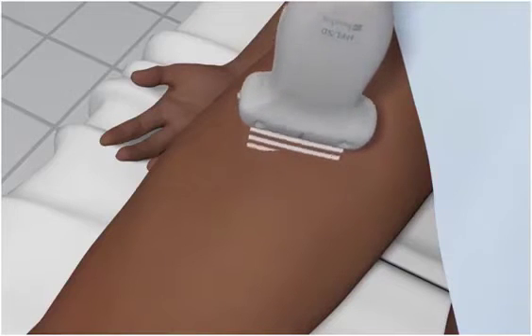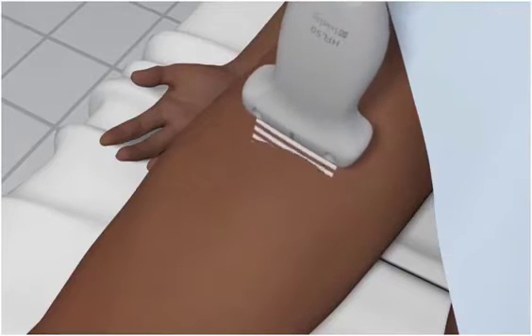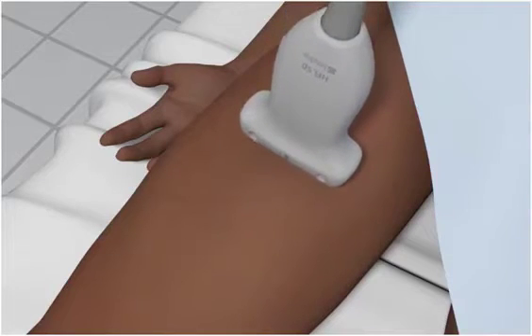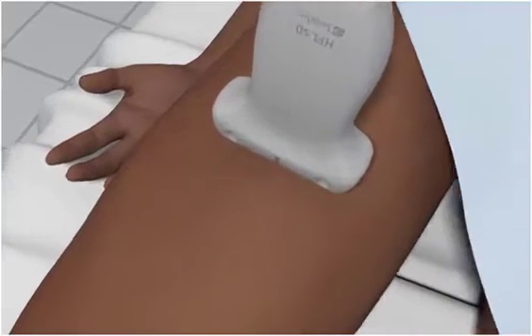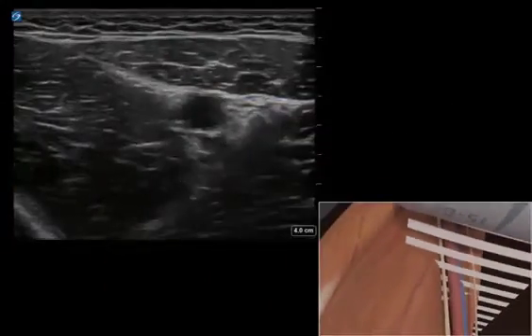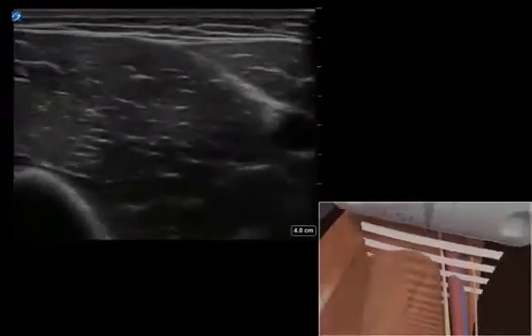The transducer is placed in the medial mid-thigh in a transverse position with the orientation marker directed towards the patient's right side.